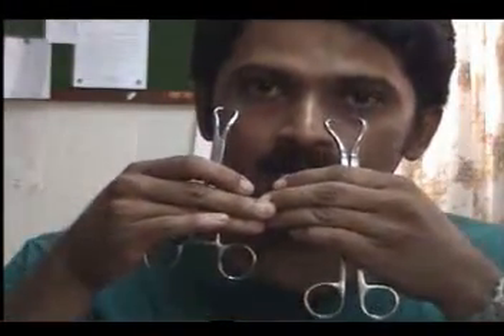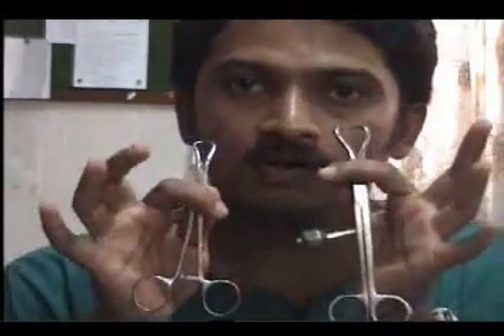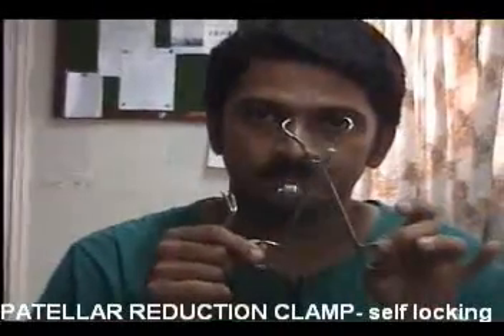If you look at these, they look alike — the handles also look alike. But when you look at the middle, you know that one of them is self-locking or self-holding, and you have something to lock it inside. This is the patella reduction clamp. Commonly used for the patella, but you can also use it when reducing the olecranon or any other piece of bone for which it is suited. Just remember that it has a self-locking mechanism. Do not confuse these two — this is a towel clip and this is a patella reduction forceps.